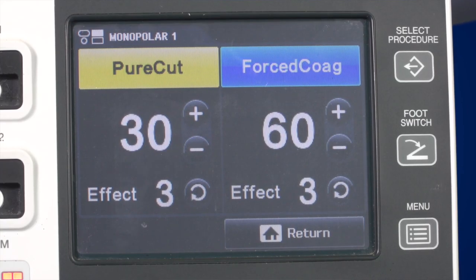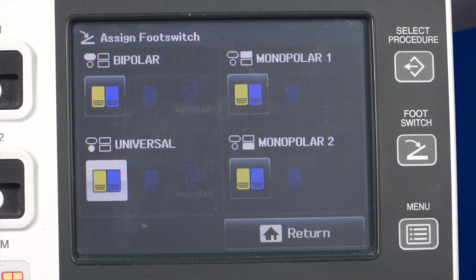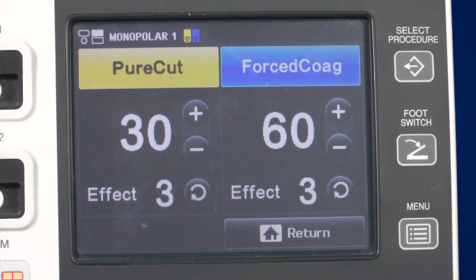Next to the display, there is a button labelled Foot Switch. Use this button to open the screen that allows you to assign the foot switch to a dedicated connection area. Once you have assigned the foot switch, it will be displayed on the screen corresponding to the connection area.